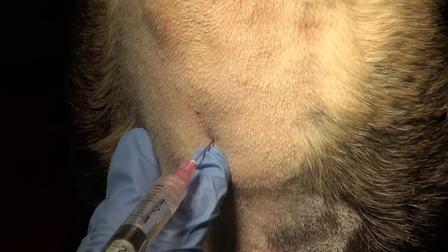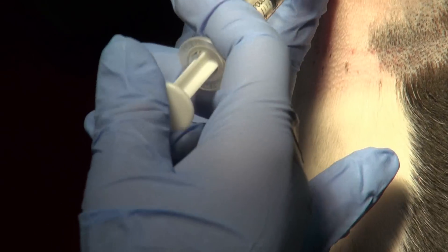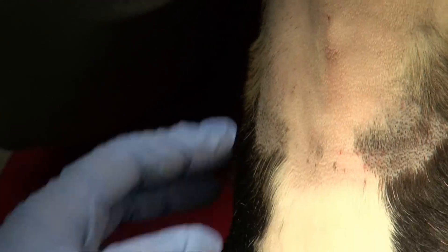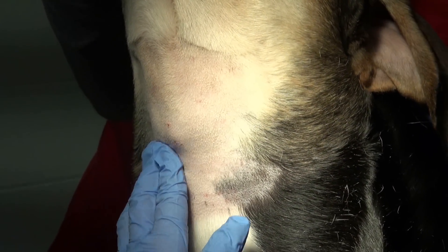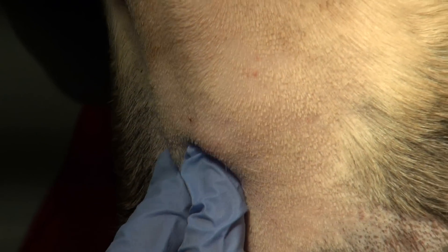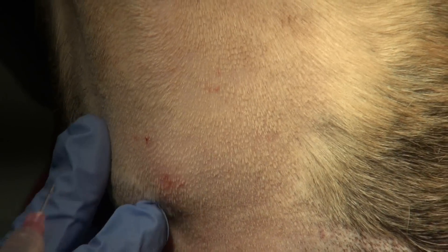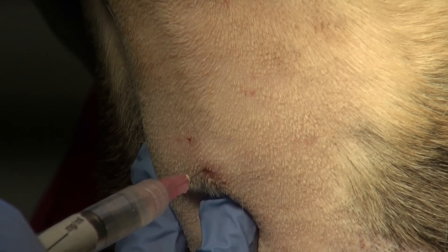As soon as we inject into the skin this dog reacts and pulls away. Rather than struggle with a moving dog we're going to stop and let the skin block do its job to make the rest of the procedure more comfortable. We'll wait a couple of minutes, then repalpate to identify our landmarks and inject through the now-numb area to block the deeper structures. This time there is very little reaction to the injection.